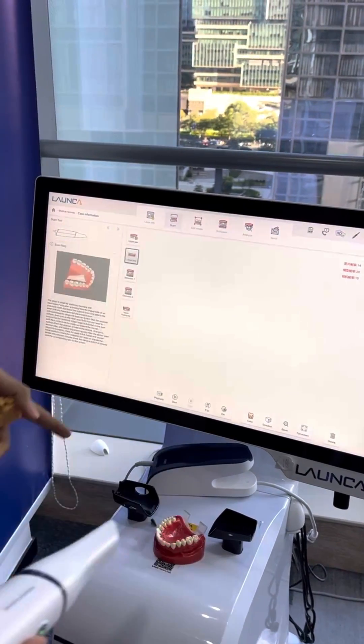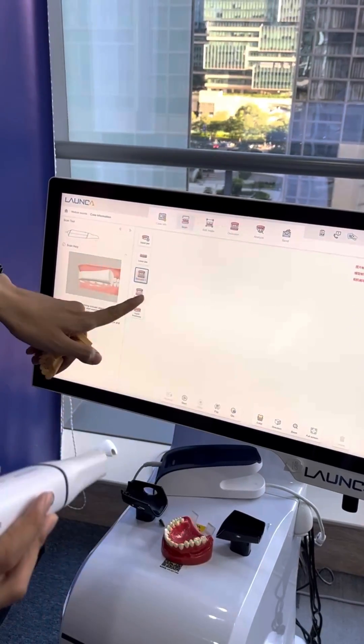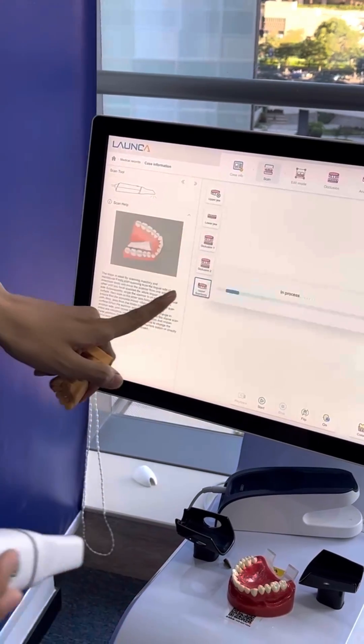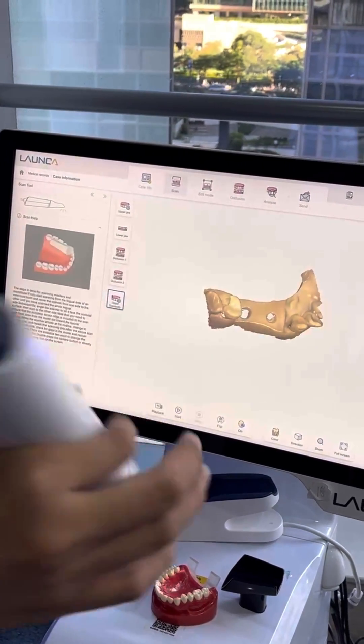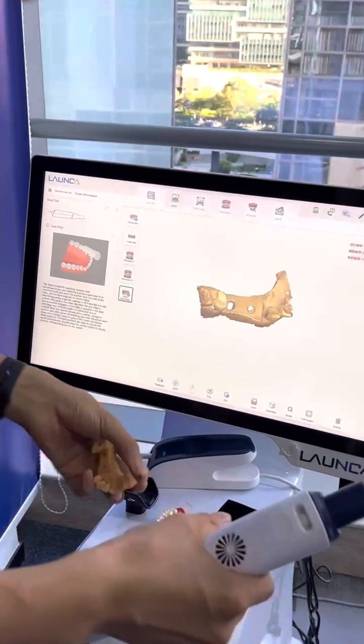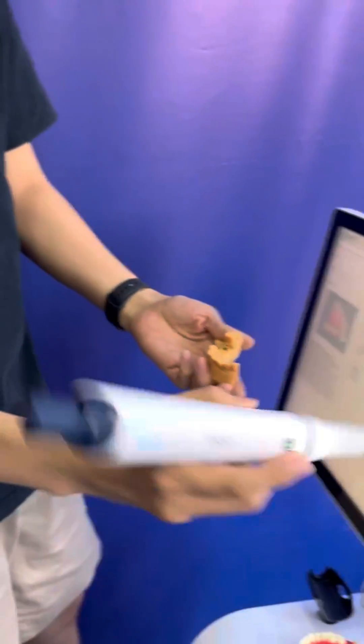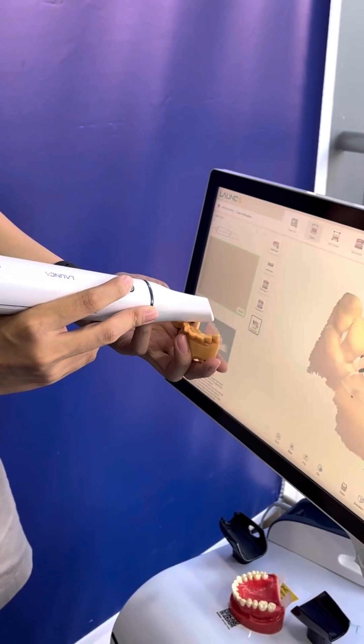Then you scan the lower jaw and the occlusion, just like a regular case. After that, you will install the scan body. Install it, press the button, and then you can scan on this model.